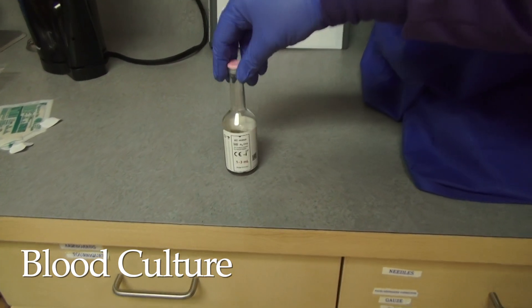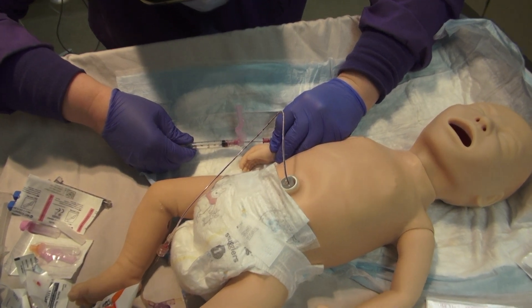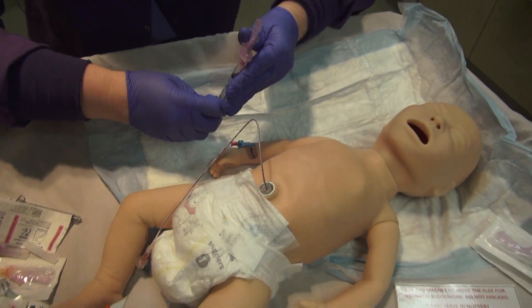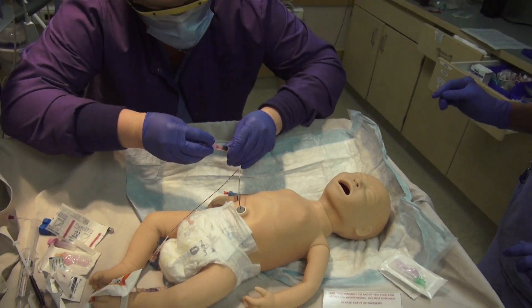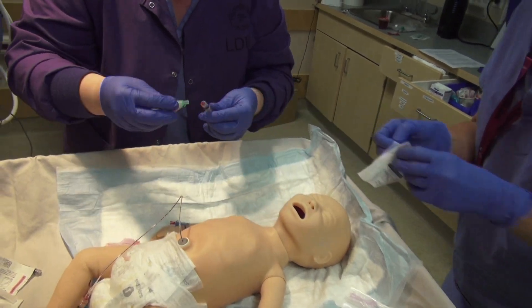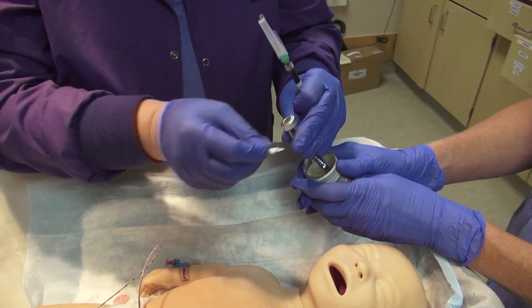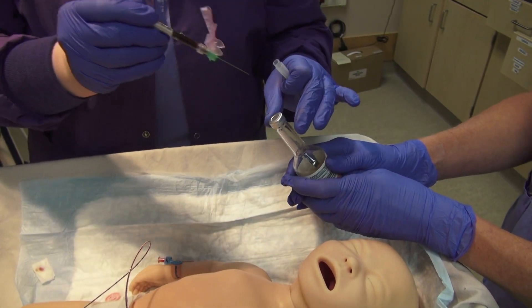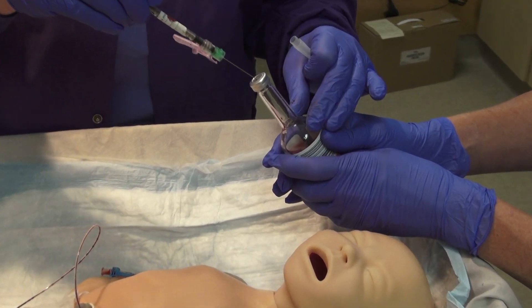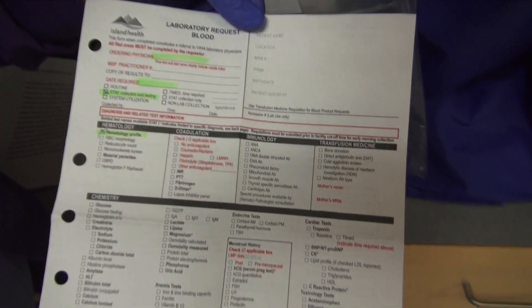Blood culture: The blood culture needs to be collected prior to antibiotics being administered to the newborn. The blood culture sample has to be a venous sample. This can be with the insertion of the peripheral IV or from the UV line. Use the pink lid. If using a UV, discard approximately 0.5 ml of blood prior to collection of your sample. Put blood for culture in the bottle before filling other tubes. Be aware the vacuum seal will take the full sample from the syringe. Pass off sample to the lab.